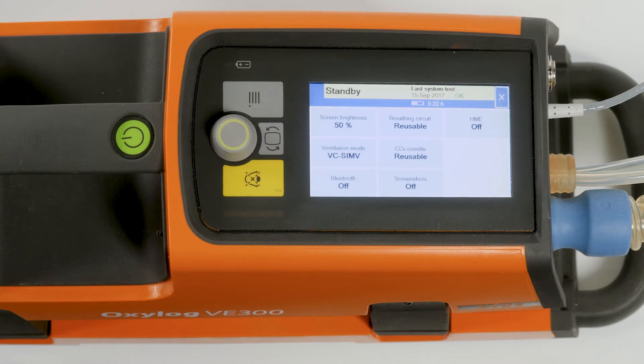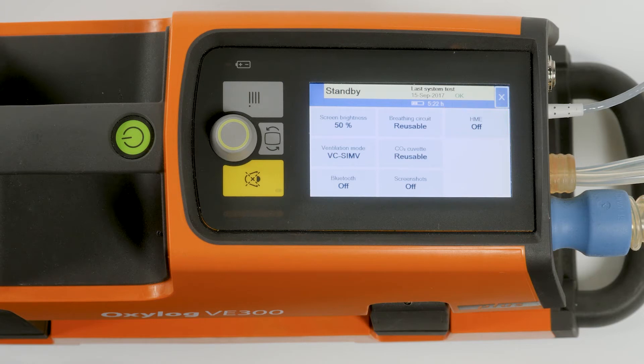The temperature and moisture of the HME have an effect on the flow measurement. The device can compensate for the presence of an HME. The following optional information is also available.